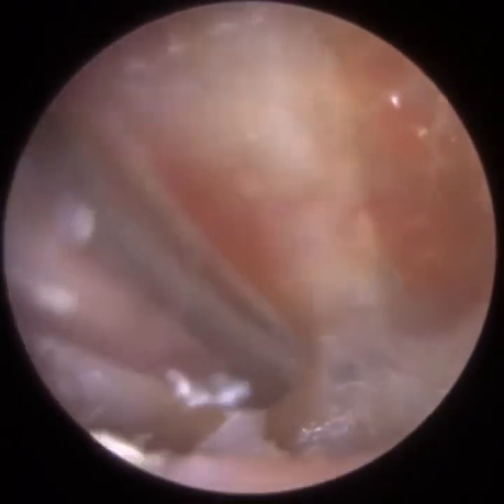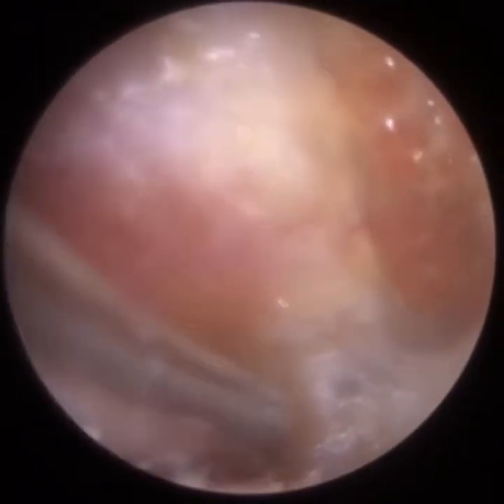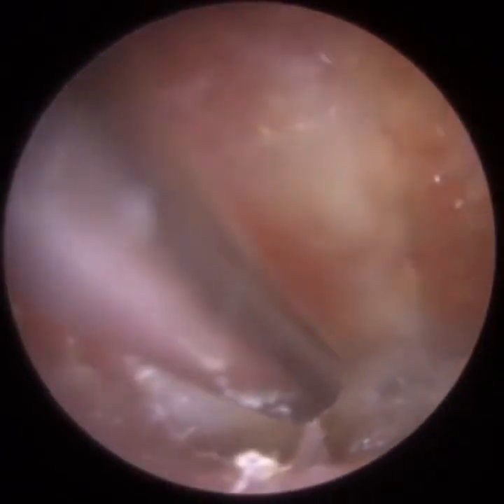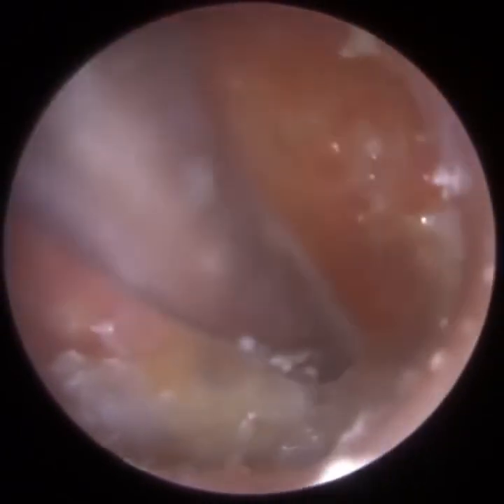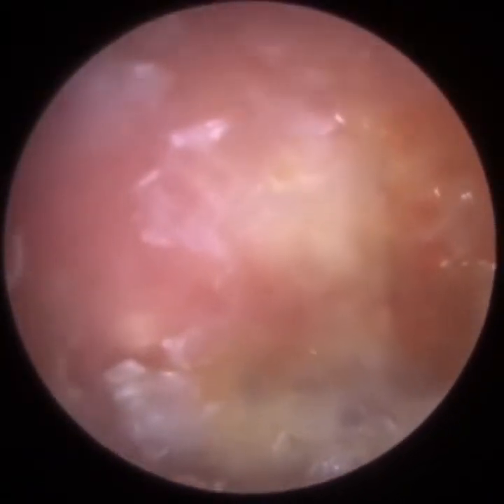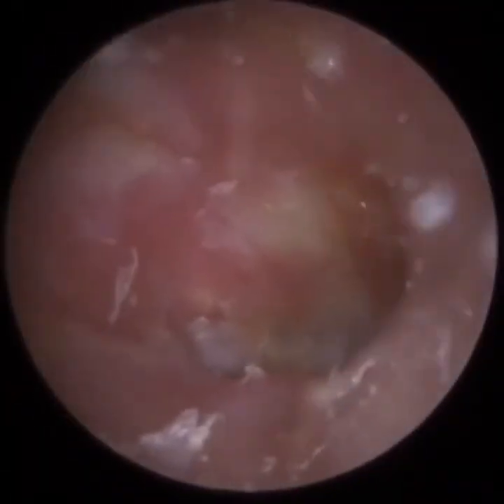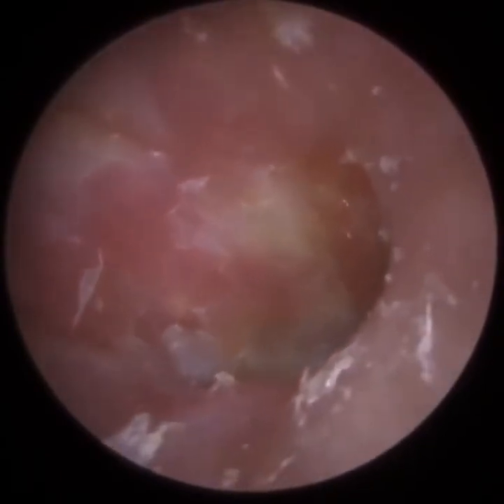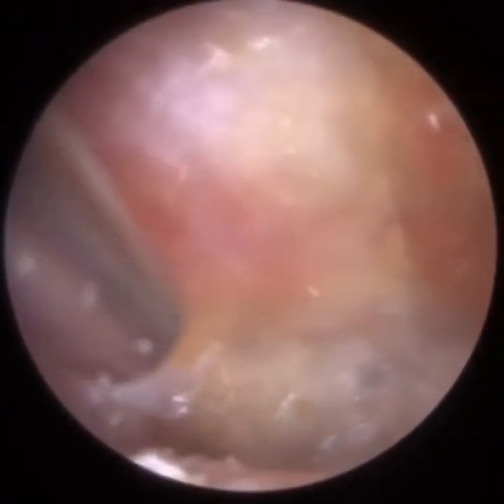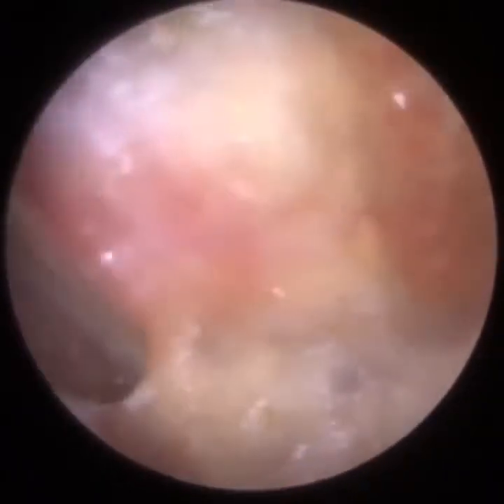So the patient has got a lot of scar tissue on the eardrum, which is unsurprising really, because the left ear is the worst of the two, and they are prone. Obviously, they do suffer from chronic ear infections, which over time cause trauma to the eardrum, and you get calcification, so calcium deposits building up on the middle membrane, where the connective tissue and fibrous layer is, and that gives it the white appearance. We call that tympanosclerosis. In extreme cases, tympanosclerosis can stiffen the eardrum so it doesn't vibrate. Quite often when I've got patients with tympanosclerosis, you do a hearing test and it doesn't really affect them as much as you think it would.